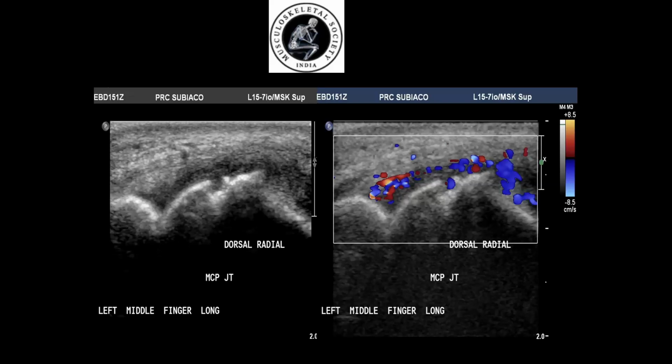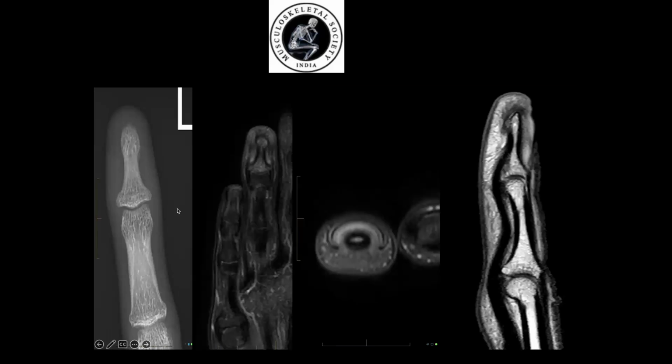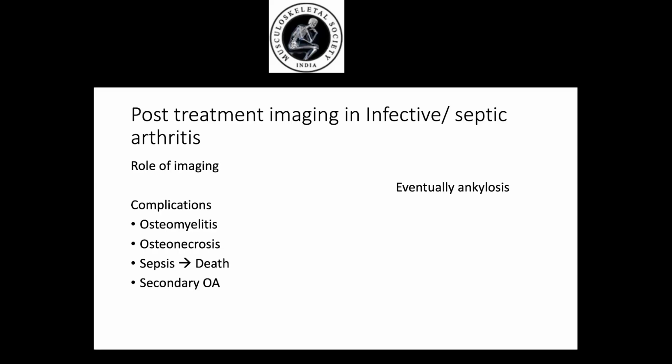So this is one of our cases from 2010, courtesy Dr. Bill Bridle. This patient had psoriatic arthritis. This is an erosion and active arthropathy with hyperemia and synovitis, no joint fusion. And that's one of my cases from 2 weeks ago. This patient has localized soft tissue swelling, and MR revealed bone marrow edema and soft tissue changes. This patient had nail dystrophy clinically, so this was diagnosed as psoriatic onychopachydermoperiosteitis. So that's to do with the inflammatory arthropathy.